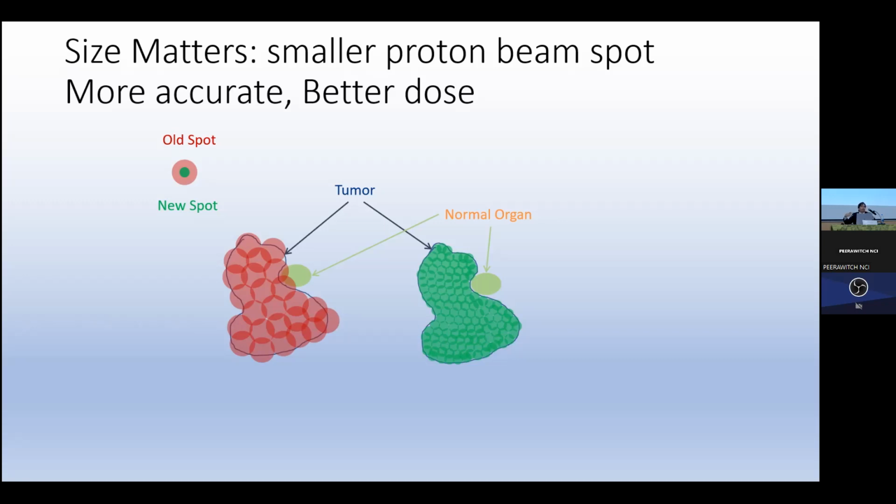What they did is they took their three or four room system and just sold it as a one room solution. That keeps the spot size actually slightly bigger, but it keeps a nice, relatively small spot size. The dose rate is relatively high. So that's a good way to do a one room system.